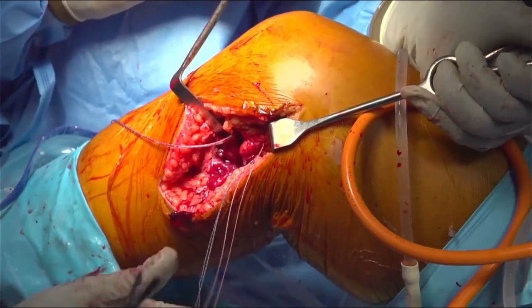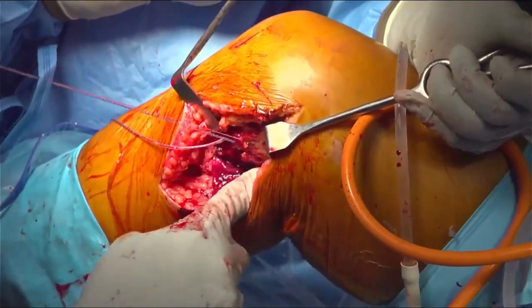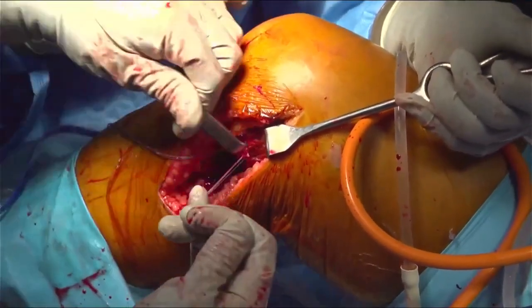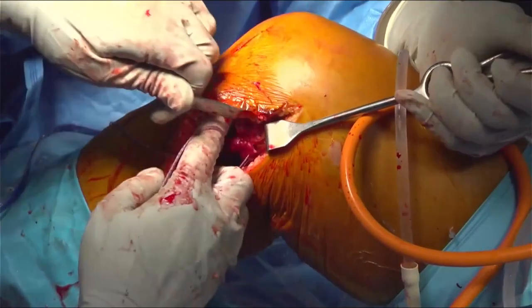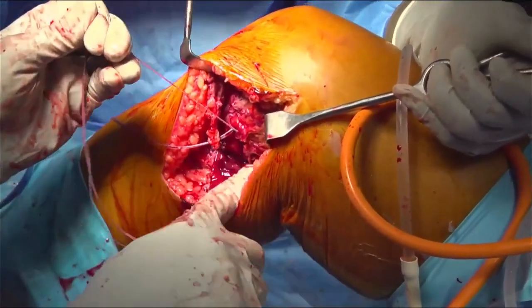Okay, so the first pass has been passed and we have repaired four of them. So we will be repairing them something like this.